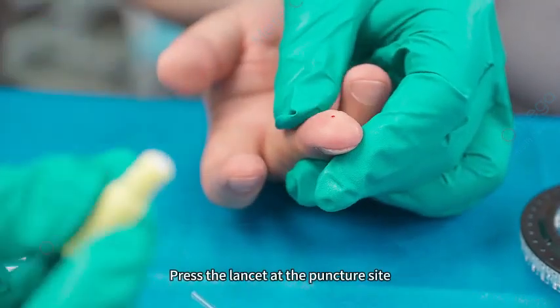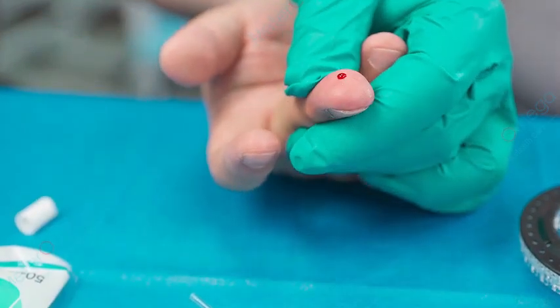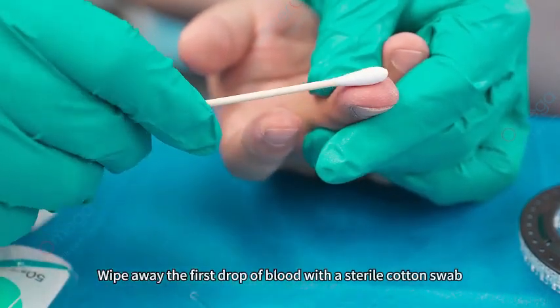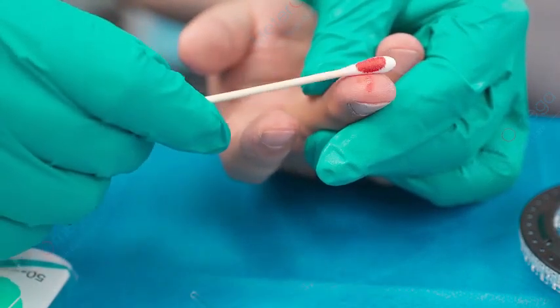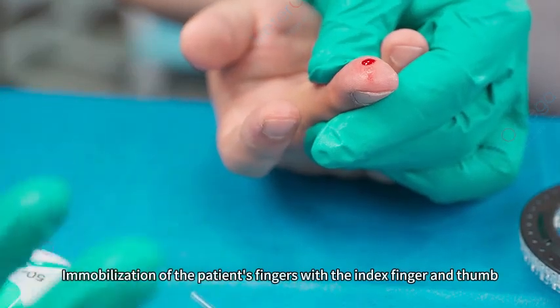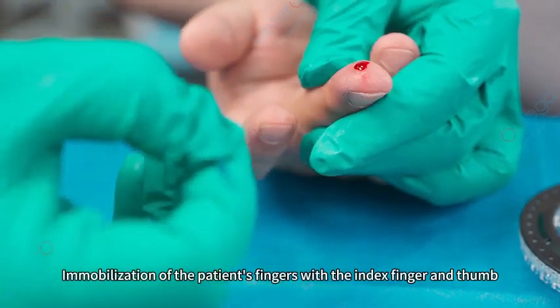Press the lancet at the puncture site and wipe away the first drop of blood with a sterile cotton swab. Immobilize the patient's finger using the index finger and thumb.